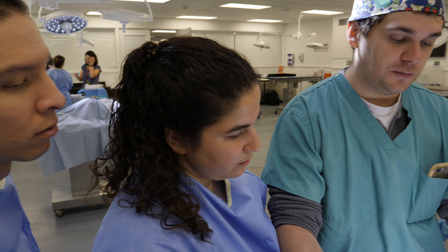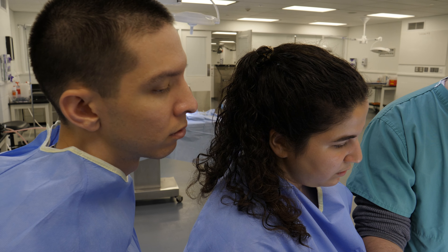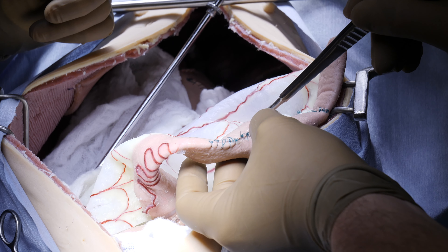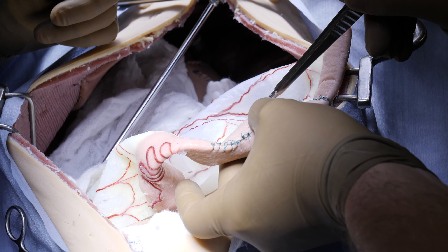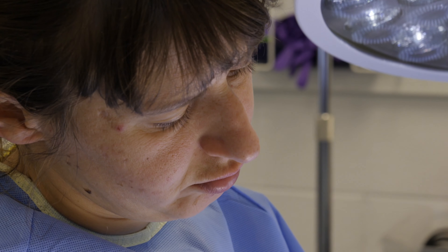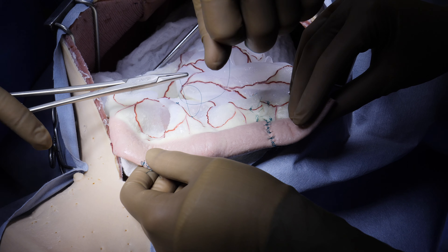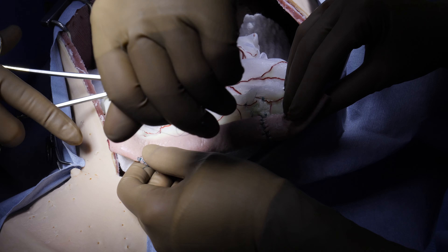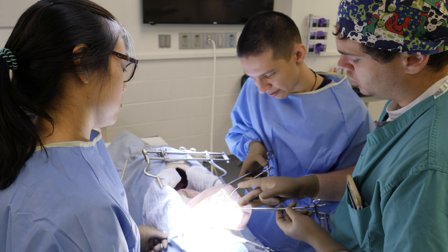If we're pretending we need to remove all the sutures of the enterotomy, what arcades need to go and what arcades need to stay? You have great blood supply from this jejunal arcade to supply from this end, so in theory, if you want to save this segment, where would you place the ligatures?